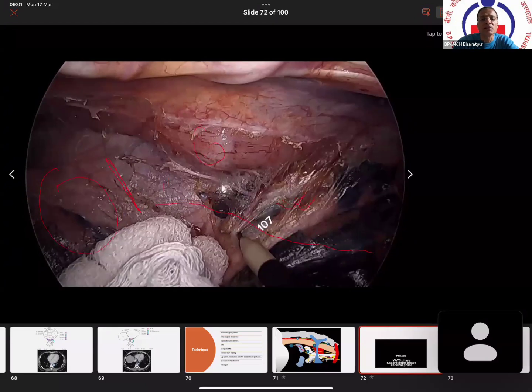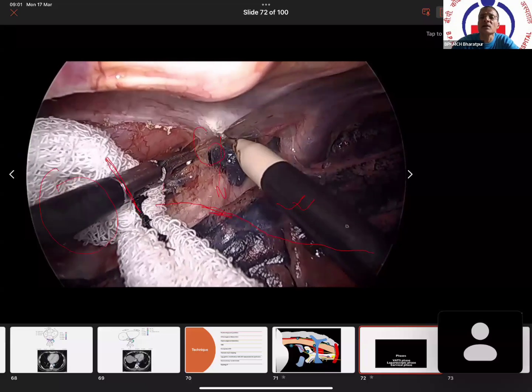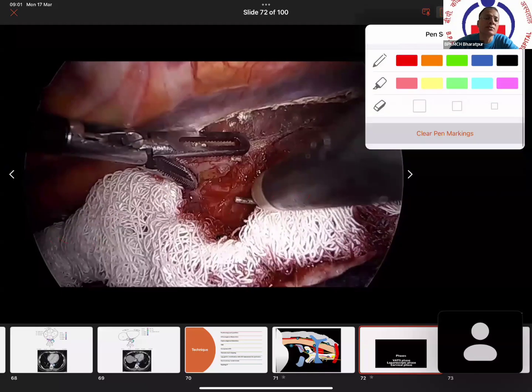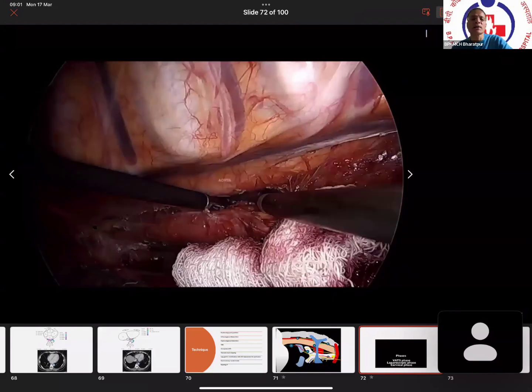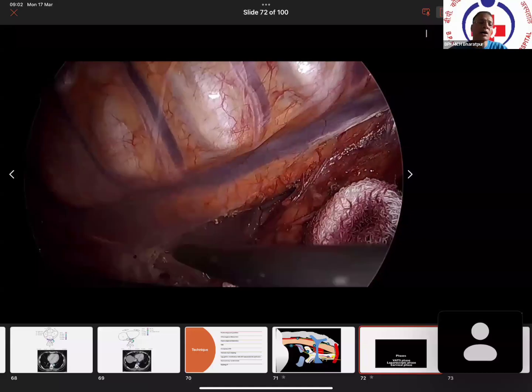We keep a distance. We should remain at least 3-4 centimeters, as far as possible, from the tumor, so that we can call it a mesoesophageal dissection. It means the tissue further beyond the esophageal envelope is being cleaned, in order to achieve a wider resection.